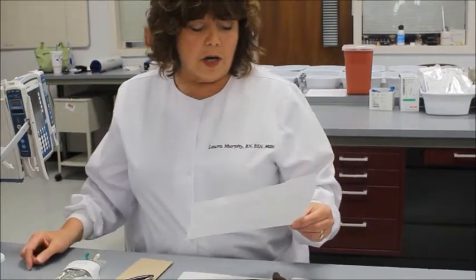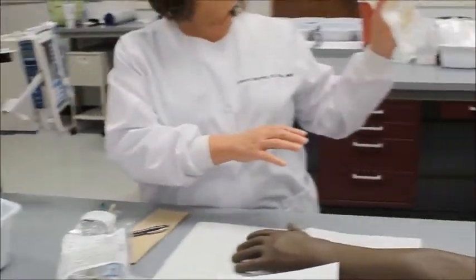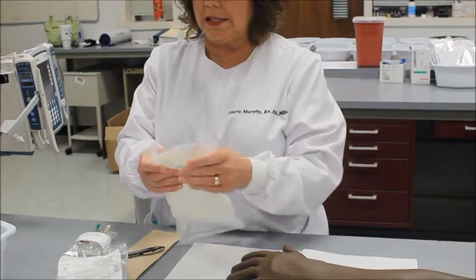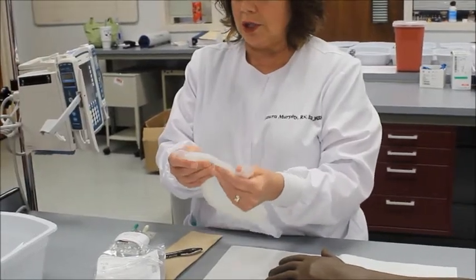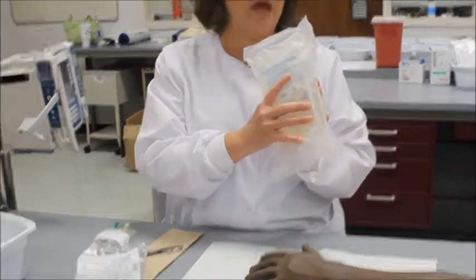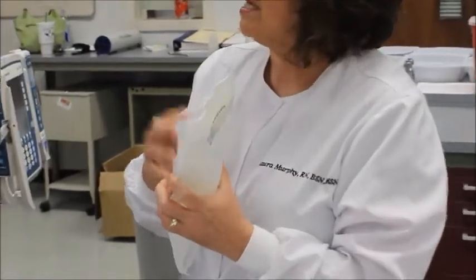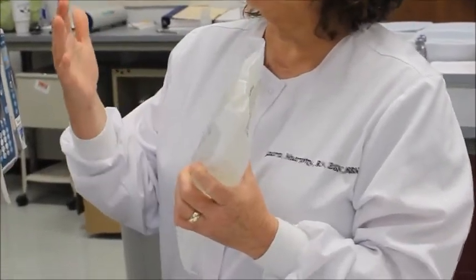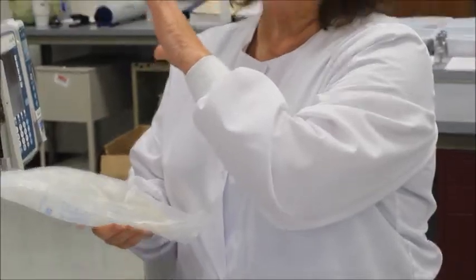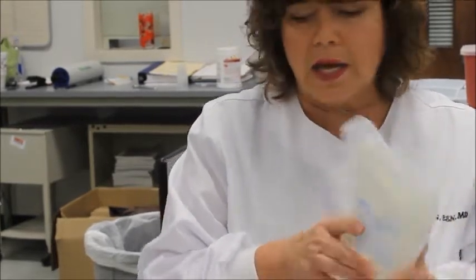Okay? All right, so to do this, I need to have correct supplies. So I'm going to get my fluid, my normal saline, 500 cc's. I want to check the expiration date. This is June of 2015. I'm looking for the integrity of the package. Okay, now if there is condensation on the inside, that's okay, guys. If the supply room is warm and we bring it out to a colder thing or whatever, it will have condensation on the inside. That's okay.